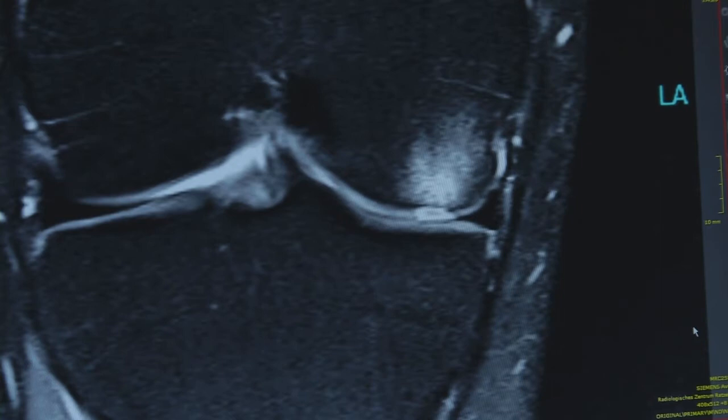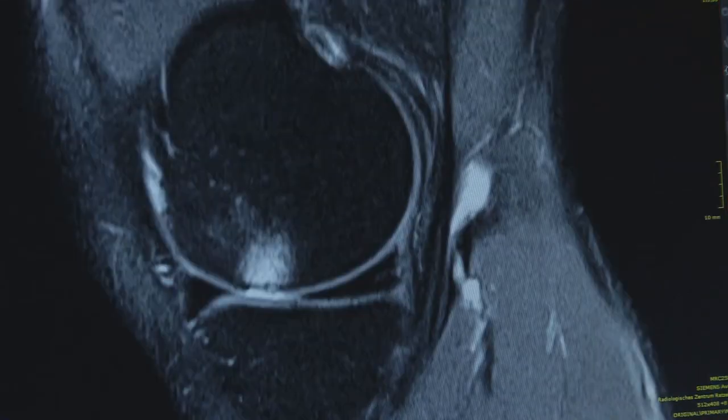On an outpatient basis, he already had an MRI of the knee and he received a hyaluronic acid injection which did not relieve the pain. When he showed up in our clinic, he had pain at the medial compartment of the knee but no meniscus sign and no instability. The MRI shows a localized cartilage defect at the medial femoral condyle, and there is a bone bruise close to the cartilage defect. So we planned the patient for an arthroscopic AMIC procedure, which we will perform today.